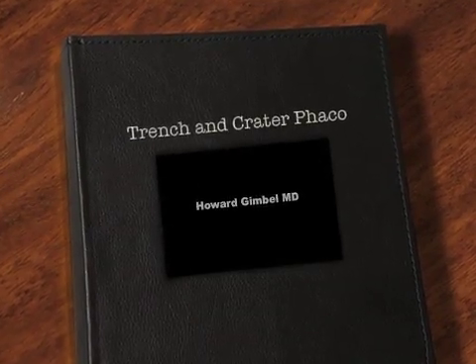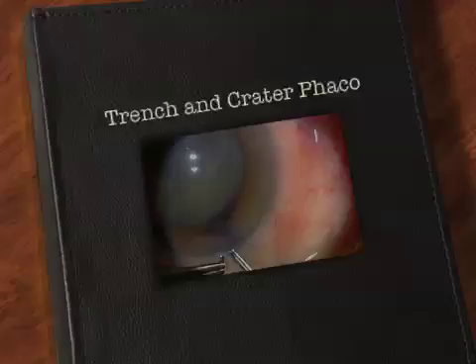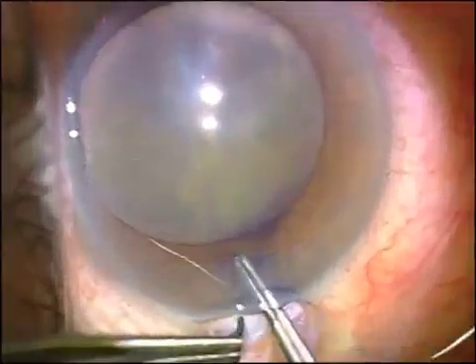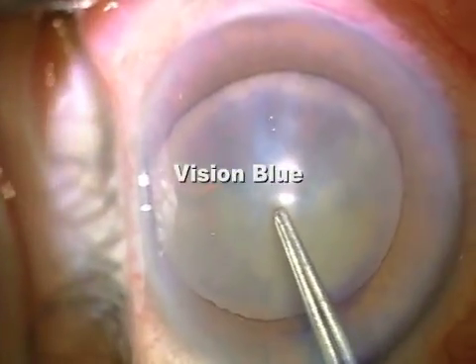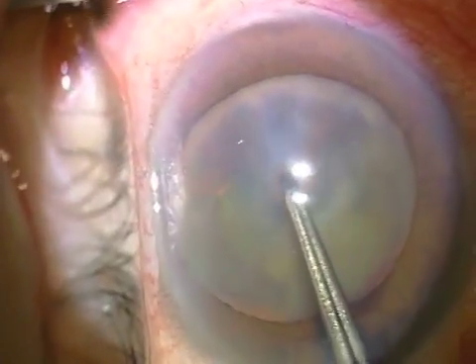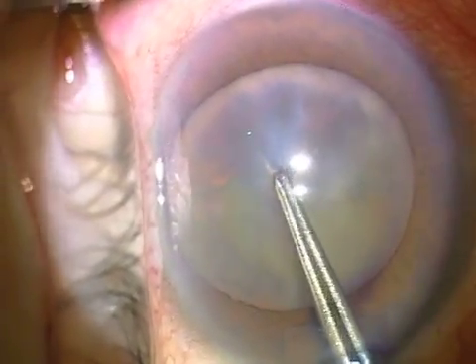I'm Dr. Gimbel demonstrating Trench, Divide, and Conquer. I'm using Vision Blue to demonstrate the capsulorrhexis. Helon 5 is my preferred viscoelastic.